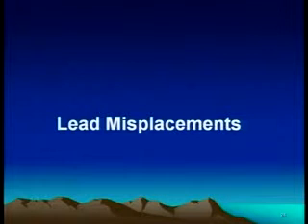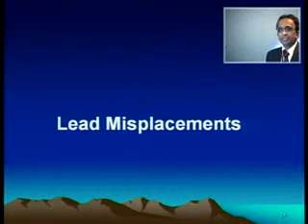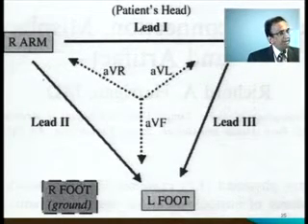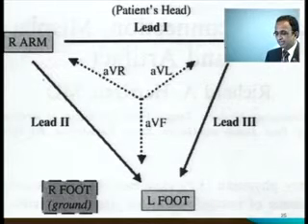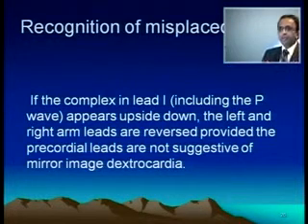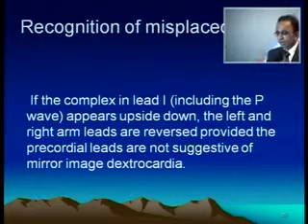Now coming briefly to lead misplacement, again commonly observed especially in ICUs and the emergency room. You know how the leads are placed, you are aware of them, and how the leads are recorded. Now you need to identify and at least be able to pick up that this has been misplaced, or these are leads which have been wrongly connected.